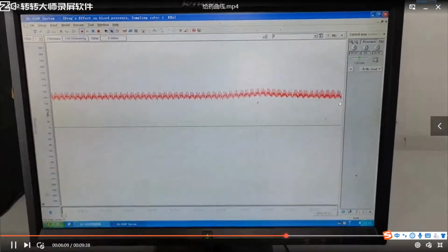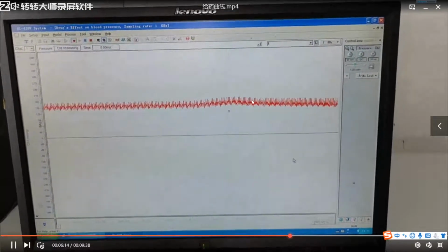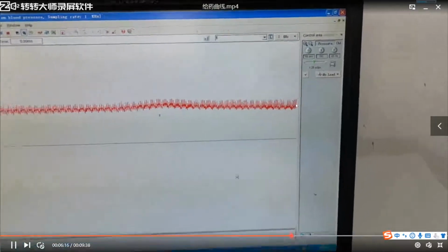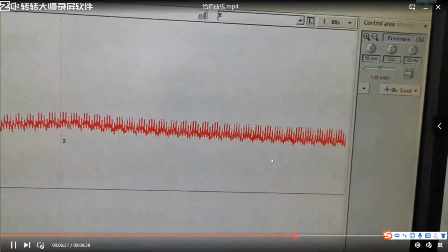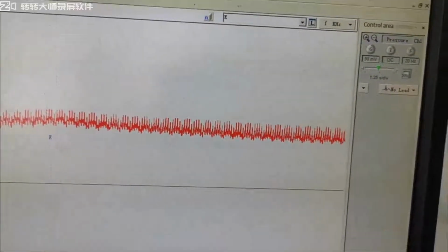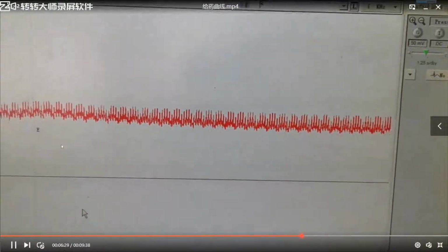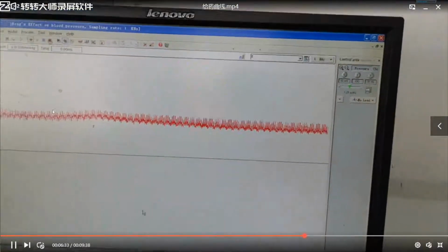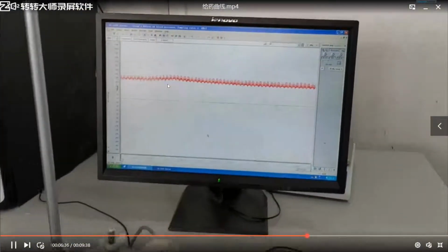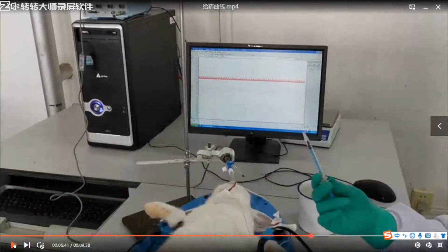But this time, after we injected it, blood pressure increased a little, but then reduced. Do you remember, you have studied the definition: adrenaline reversal. Why? Because we used the alpha receptor blocker phentolamine, so the alpha receptor is blocked, and though we give adrenaline, adrenaline couldn't increase the blood pressure again.